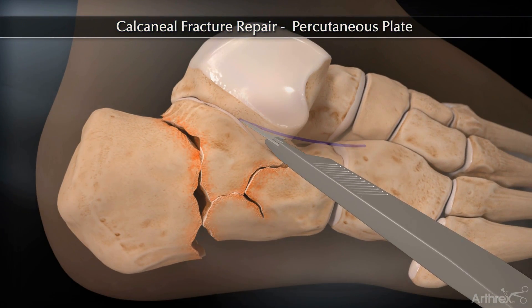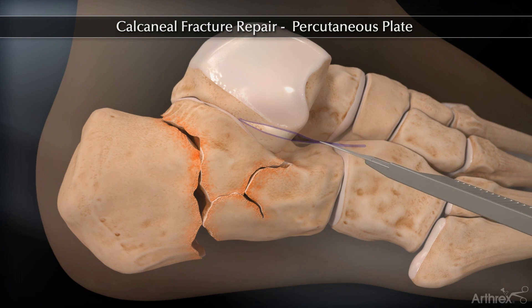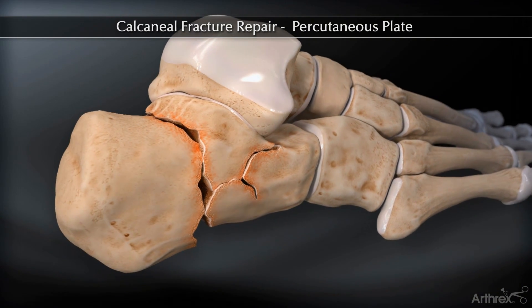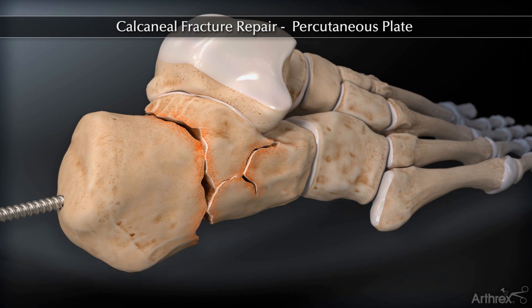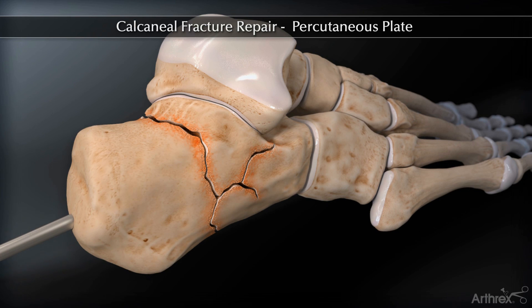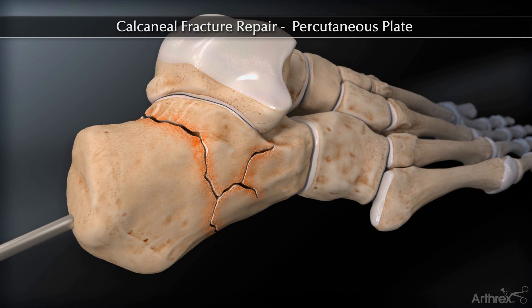A sinus tarsi approach is used for the incision. Insert the 5 mm Shanz pin into the calcaneal tuberosity; this may be placed posterior or lateral. Reduce the fracture using the Shanz pin and the calcaneal-specific elevators.